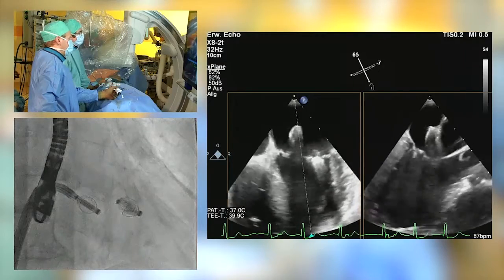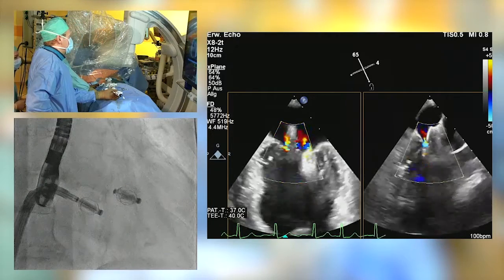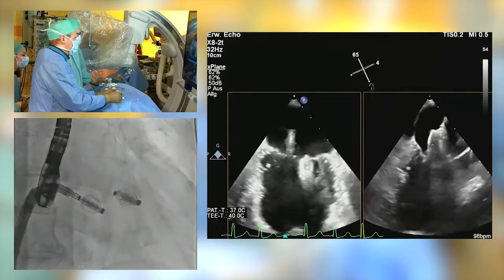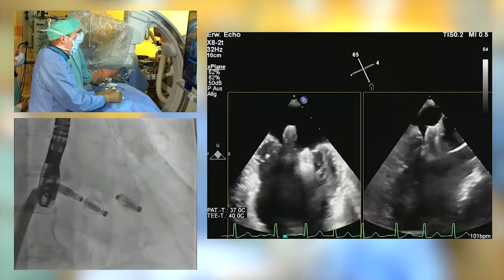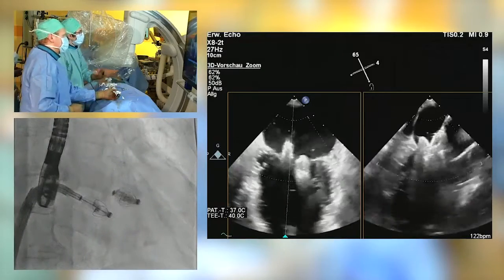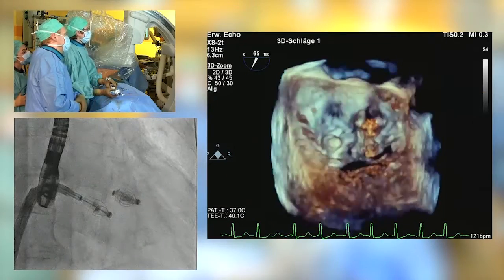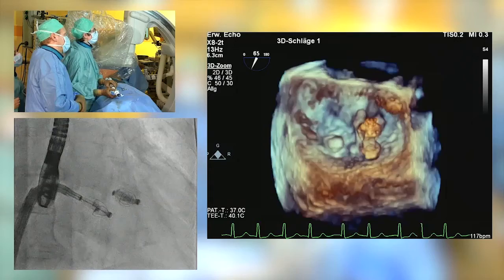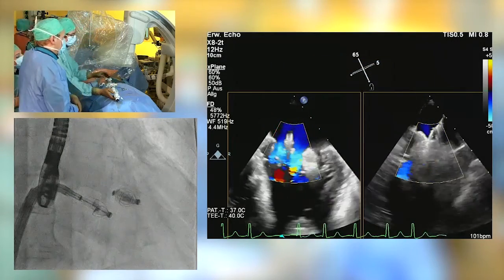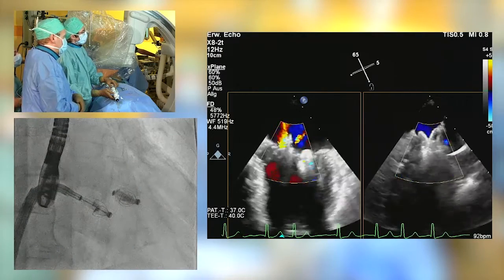Okay, this device is now supposed to go into the medial jet. What we also discussed at that point is that maybe we try to get the leaflets nicely on, but maybe not too tight, to have good MR reduction, at the same time preserve adequate opening of the leaflets and of the valve during diastole to end up with acceptable gradients. So we don't place this device exactly next to the first, but right at the position where we see the largest MR jet, and this is in slight distance to the first implant.